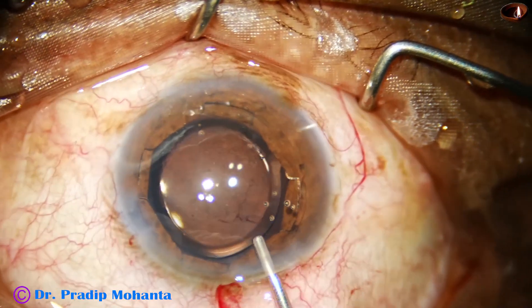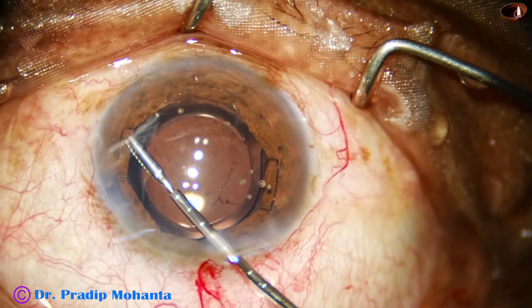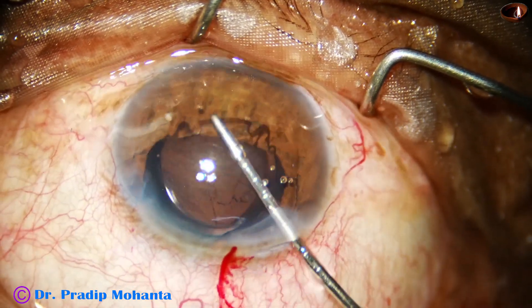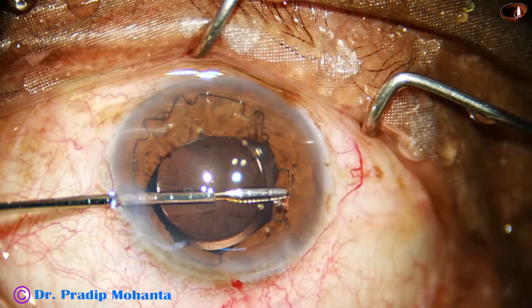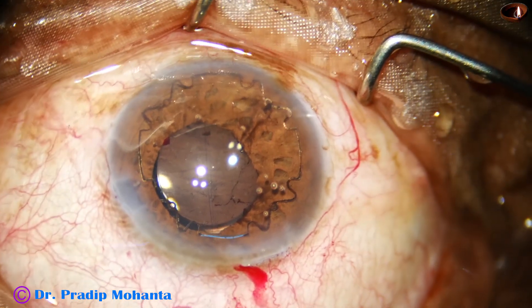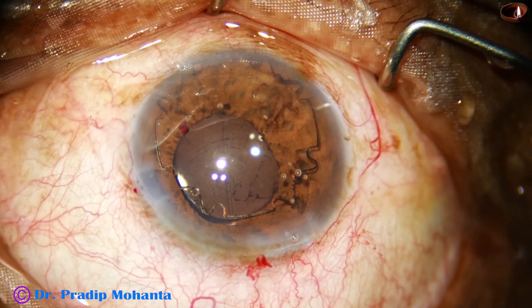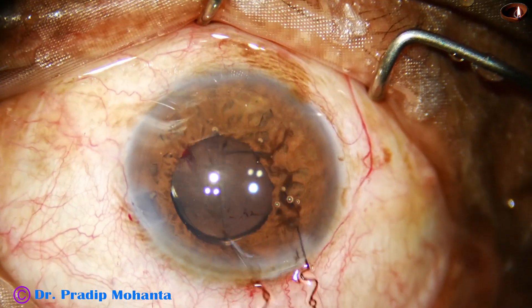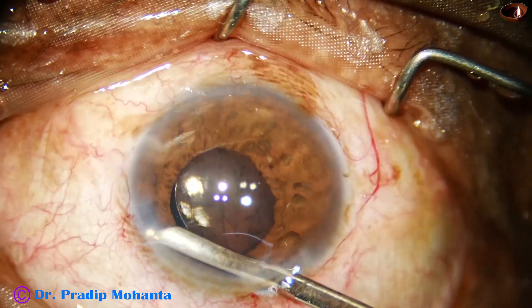Now we are going to remove the B-Octa — see how it is removed. Go and hold a flange which is above the iris, pull it centrally, and again go over the iris. Half of the B-Octa is now in front of the iris. Go through the side port, hold another flange, pull it centrally, and again go over the iris to periphery. Now the whole B-Octa is in the anterior chamber. Inject some visco, then go through the main wound with B-Hex forceps, hold the B-Octa at any place, and gently pull it out. The pupil has come down to about 3.5 mm.